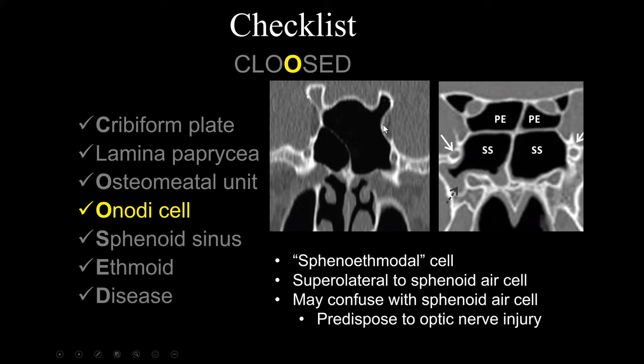During endoscopic sinus surgery, it's important to make surgeons aware of sphenoethmoidal air cells — otherwise known as onodi air cells — because a surgeon may confuse the sphenoid air cells with the onodi air cells, predisposing these patients to optic nerve injuries. Here is another example of a patient with sphenoethmoidal air cells where, looking superiorly, there is a completely opacified onodi air cell. The surgeon coming through the sphenoethmoidal recess may think this is the roof of the sphenoid sinus when in fact it is an opacified onodi air cell.